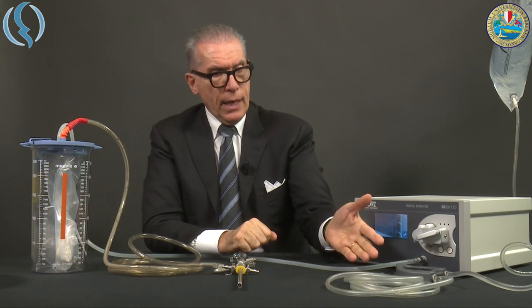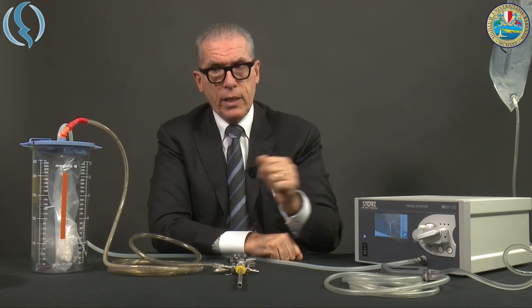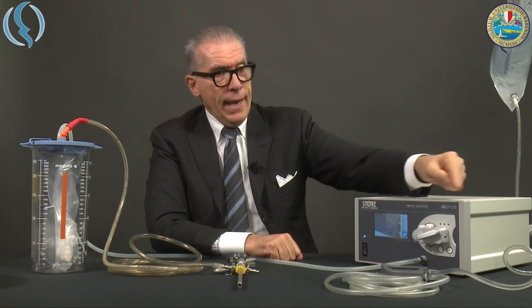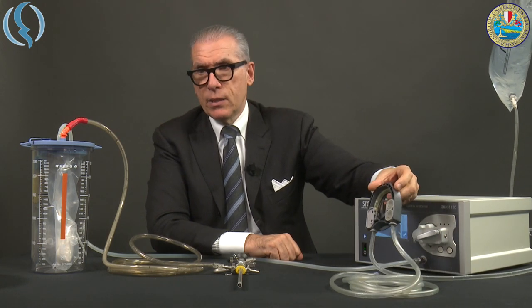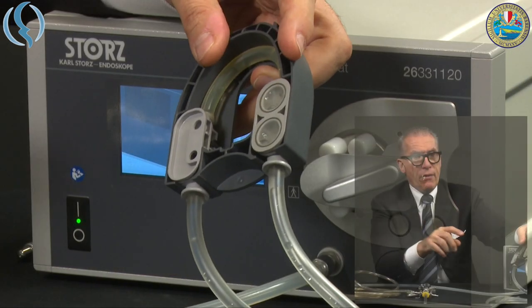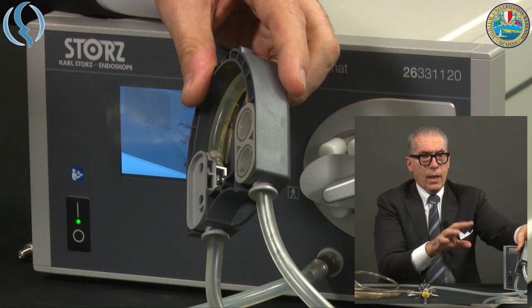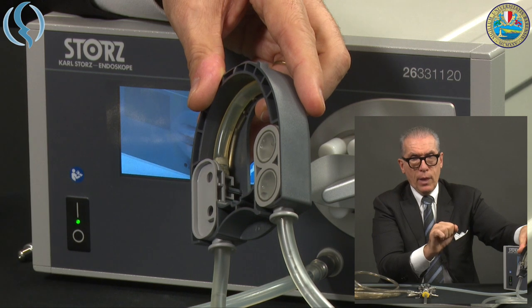The irrigation tubing set is much easier than the previous one. There is only one cable with Y connectors that goes to the sac, and then into a plastic adapter. This adapter contains everything — in the previous version everything was separate: we had the membrane for the pressure system, the connectors, and the tube inside.